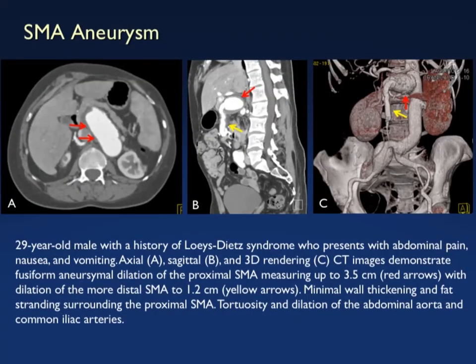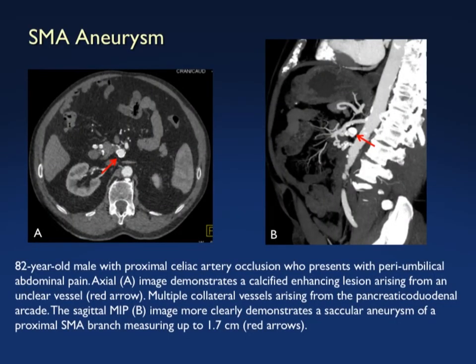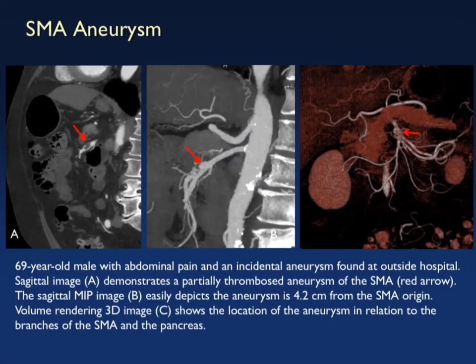Here is a nice example of a patient with Loeys-Dietz syndrome with a very large SMA aneurysm — about as large as it gets. There's also another patient with proximal celiac artery occlusion and an aneurysm off the SMA, and another example of an SMA aneurysm with thrombus present. Our routine use of 3D imaging makes it very easy to detect these aneurysms.